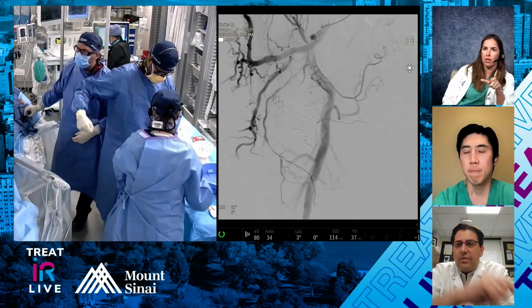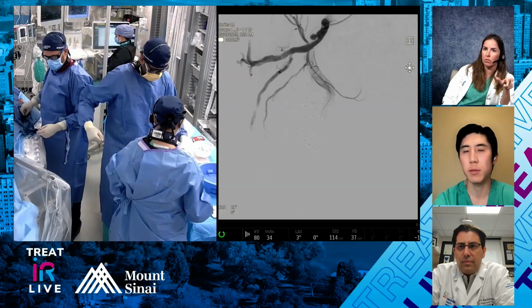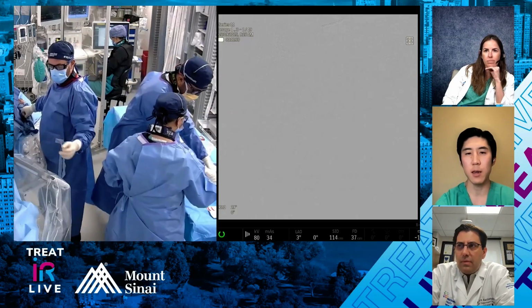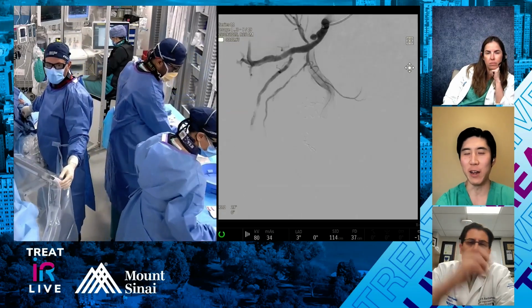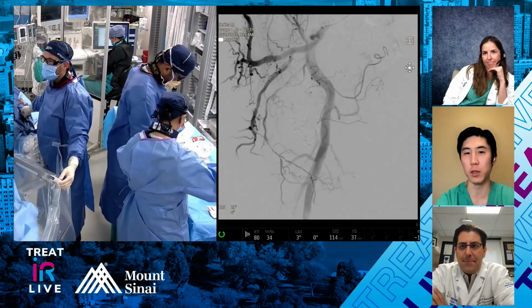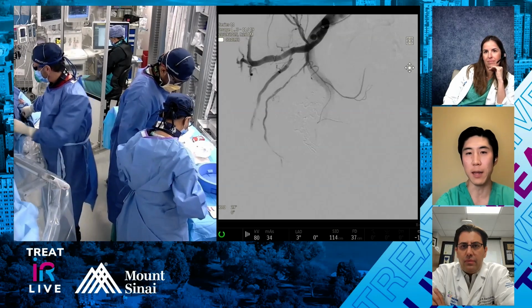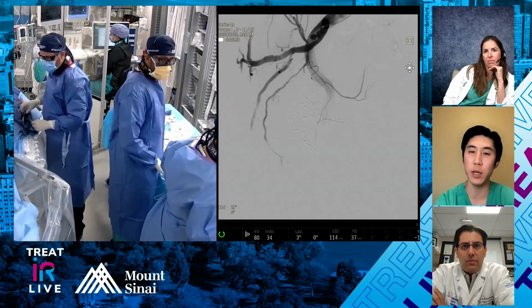When you're using versus not using a Sniper catheter, Art was asking about dilution. Are you adjusting the dilution of your glue? I think this is like the art of it, right? It also depends on how fast you're injecting the glue or how slow you're injecting the glue and how big the prostate is. What is the patient's cardiac output? That's pretty good. And I think that has a difference in the polymerization rate.